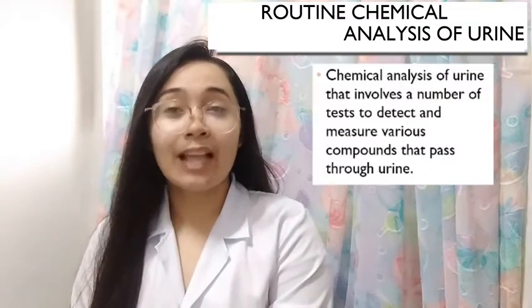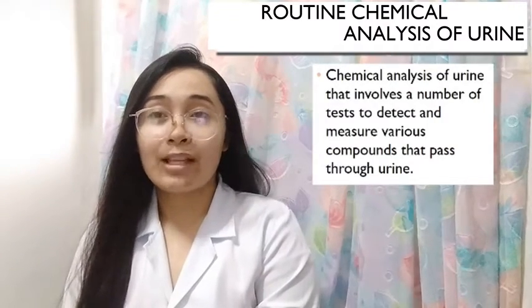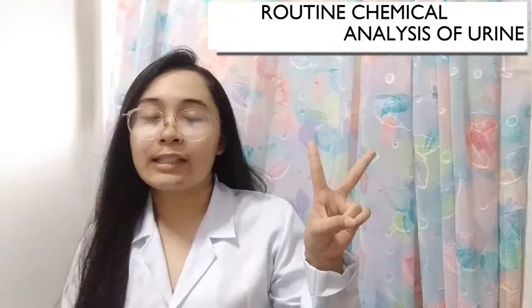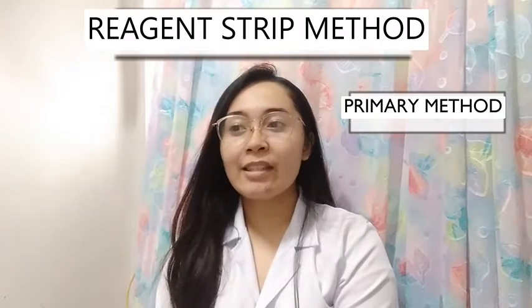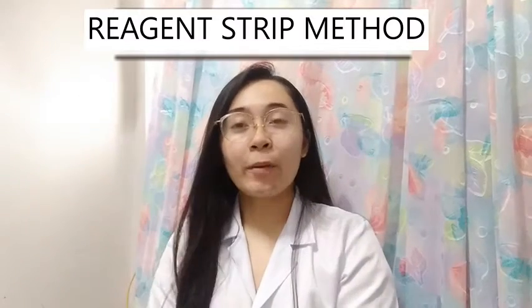Routine chemical analysis or examination of urine is the chemical analysis of urine that involves a number of tests to detect and measure various compounds that pass through the urine. It uses the reagent strip and has two major types: the Chemstrip and the Multistix. Reagent strip method is the primary method for chemical analysis of urine. It is simple and rapid in performing medically significant analysis. This includes pH, protein, glucose, ketones, blood, bilirubin, urobilinogen, nitrite, leukocyte esterase, and specific gravity.